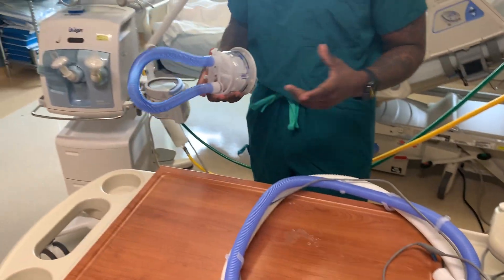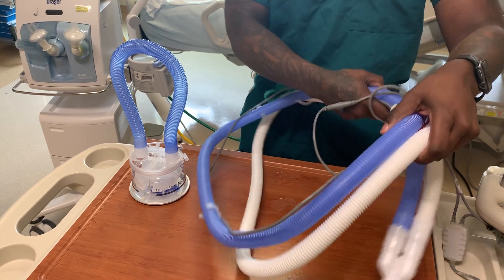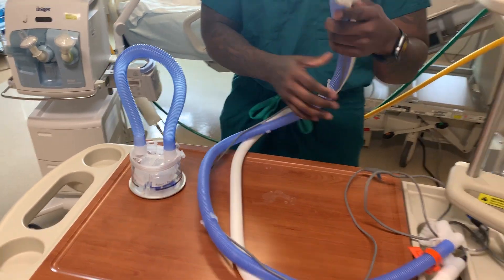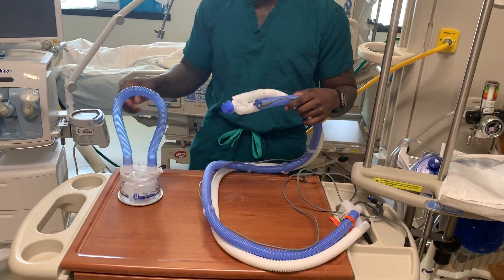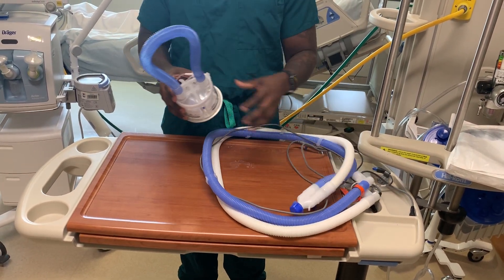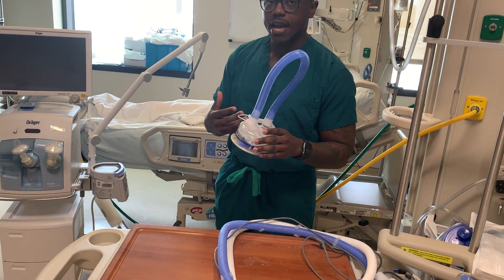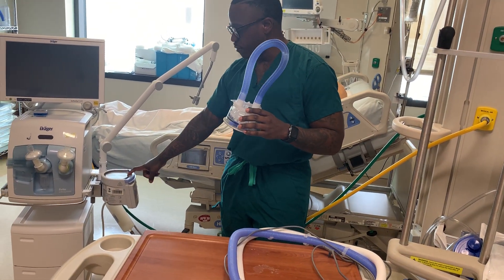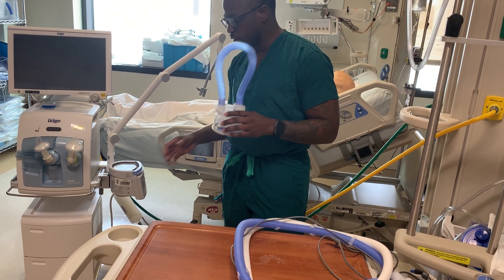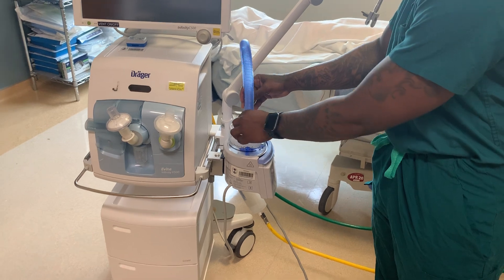With our ventilator today, we have a heated wire circuit, so I'm going to be connecting active humidification to it where water will fill into here. This provides active heated humidification via this external heater. I'll just slide that in right there.